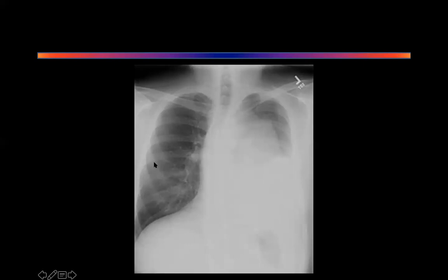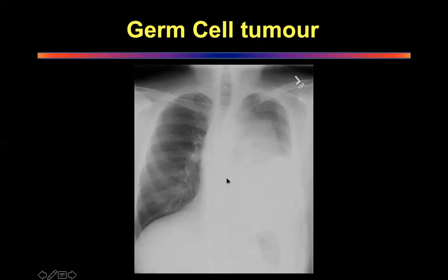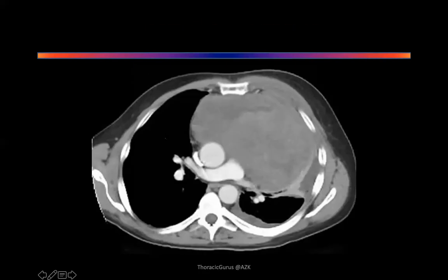The outermost portion is the normal lung. More medial to that is hypodense. Yeah, what is it? Give me something. Aortic aneurysm. Maybe a pleural thickening or mass lesion over that. It's a mass. Okay, there is a mass in there. I wanted to say there is probably a mass in there, some sort of tumor. It looks tumorous. It doesn't look like pleural effusion because of the irregularity. Stay with me and give me the next one. Same patient, give me this.